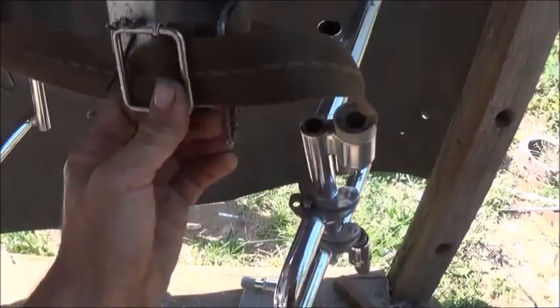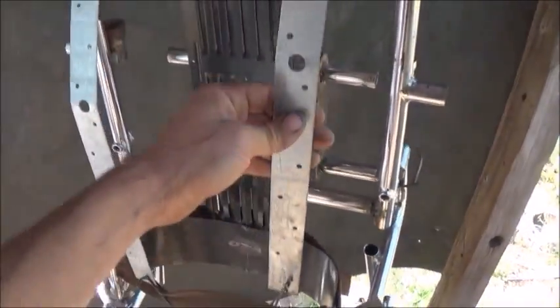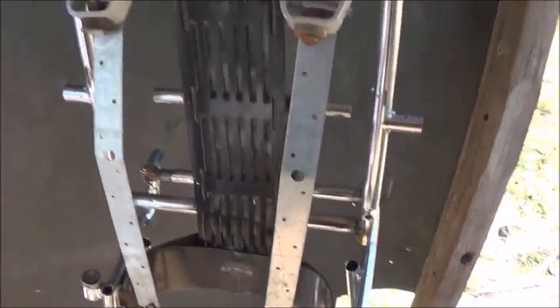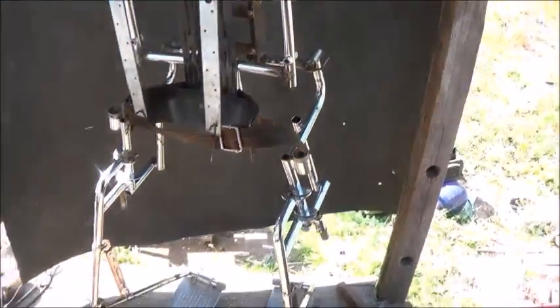I've actually got it set up for double belts — you can see the other buckle loop underneath right here, but right now I just have a single belt on there. These shoulder straps come down and the belt goes through them down here at the bottom so it all holds into place, giving you a really nice harness to hold you into the exoskeleton suit.